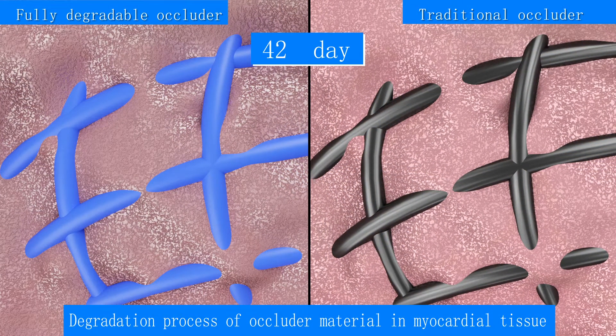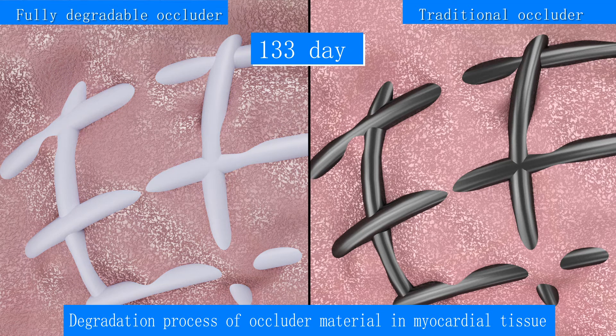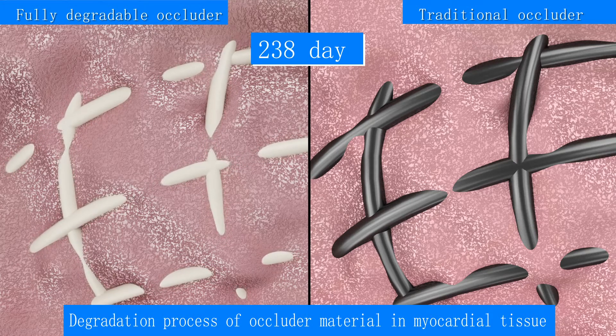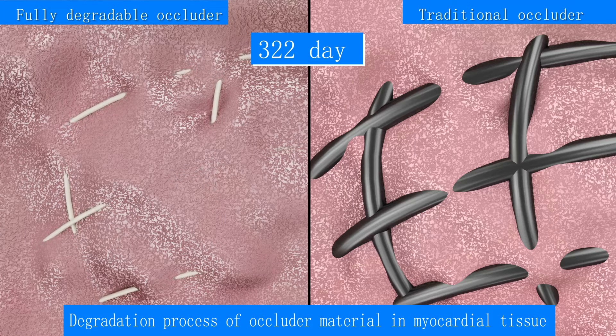The overall use of fully degradable polymer medical biomaterials, compared with traditional occluders, MemoSorb is completely degraded into carbon dioxide and water after one year of implantation without any device materials remaining.